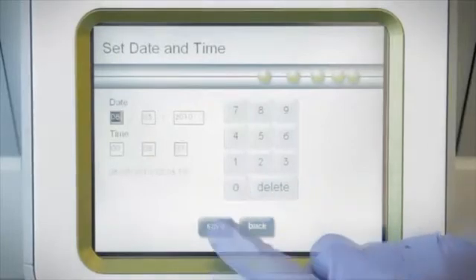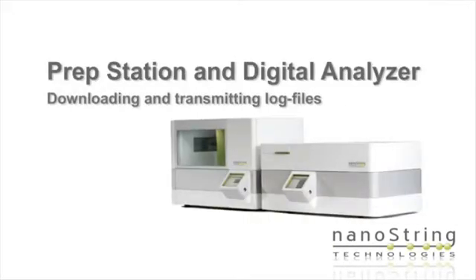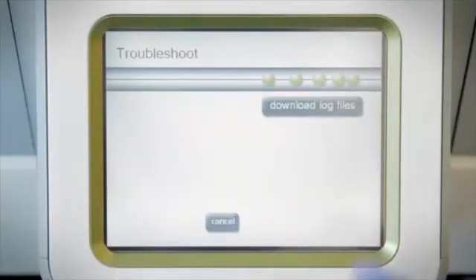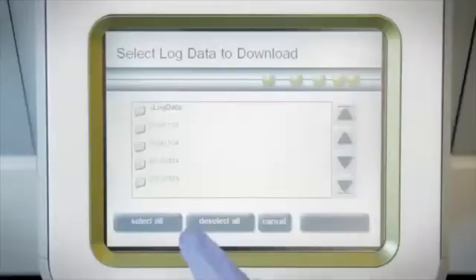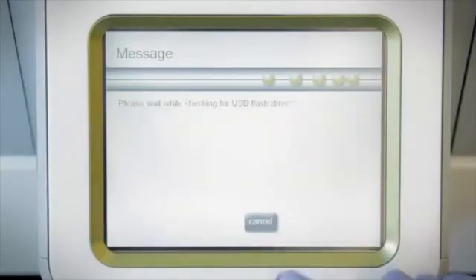On both instruments, a tremendous amount of data is collected into log files, which are invaluable for us at NanoString for determining what has happened when things might have gone wrong. We will often ask you to collect log files when there are problems. To do this, simply go to Maintenance, Troubleshoot, Download Log Files. Insert a USB stick into the side of the machine, and then navigate to the folder or folders of the date when the log files need to be collected.